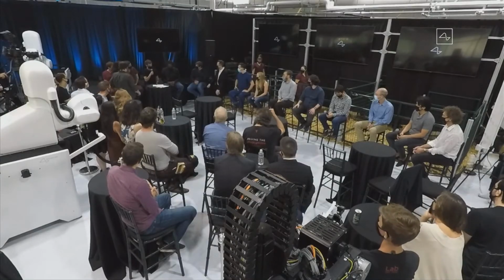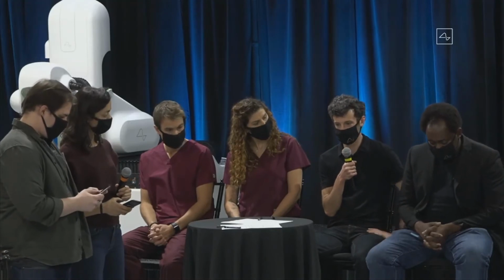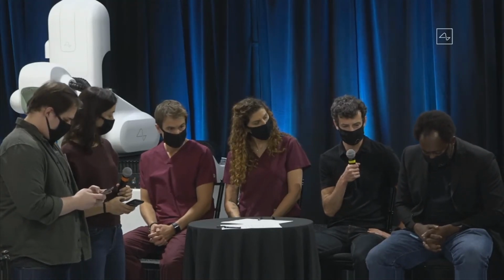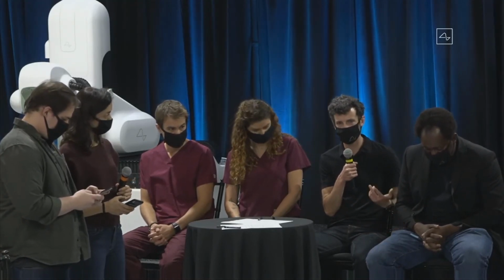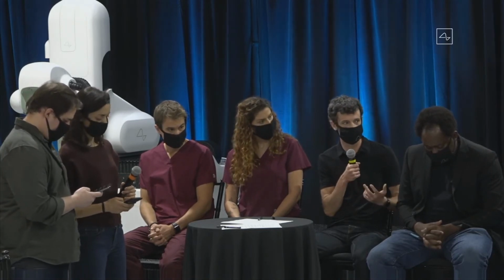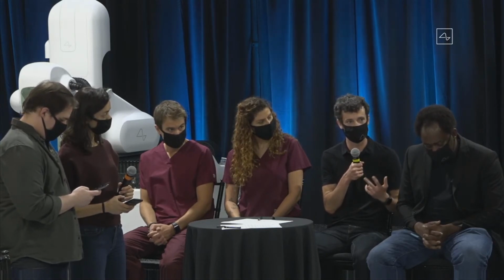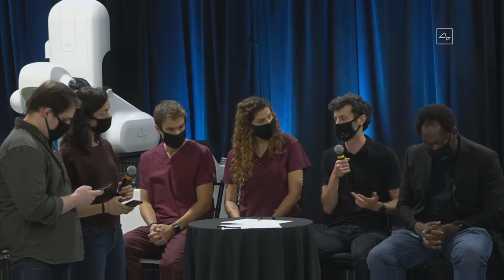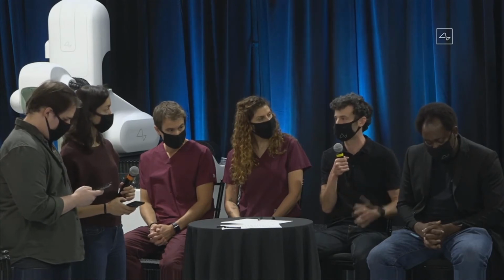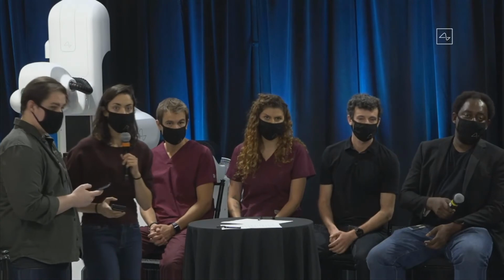Anyone? Yeah? So, hey, I'm Zach. I work on the microfabrication team. I help make implants. One thing that I think is really cool, just in general, is that this is a platform, essentially, so we can change the design up in a variety of ways. If we find that a certain design or electrode size or number of electrodes works better in different areas of the brain, we have the capability to do that. I personally think that's very cool.